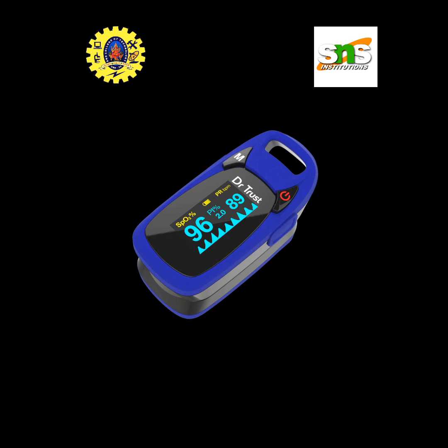A healthy person should be able to achieve normal blood oxygen saturation levels, or SpO2, of 95% to 100% consistently. If the SpO2 value is 91 to 94%, it is considered mild hypoxemia.